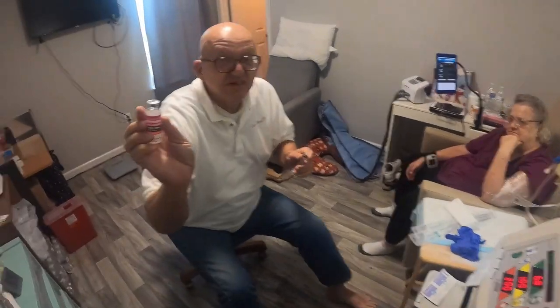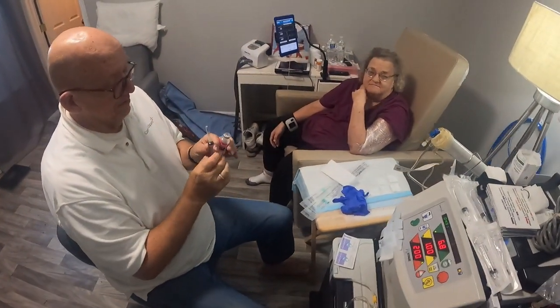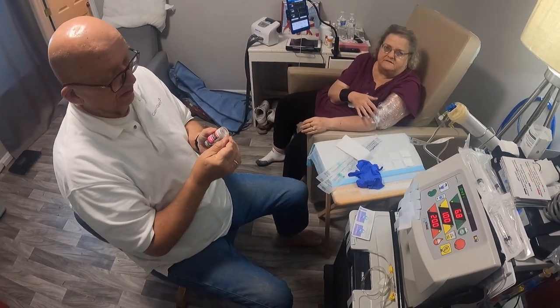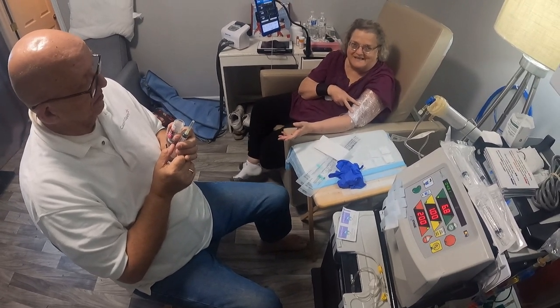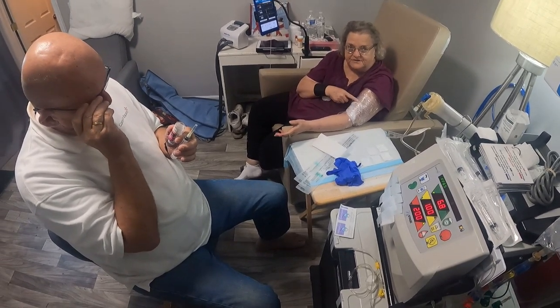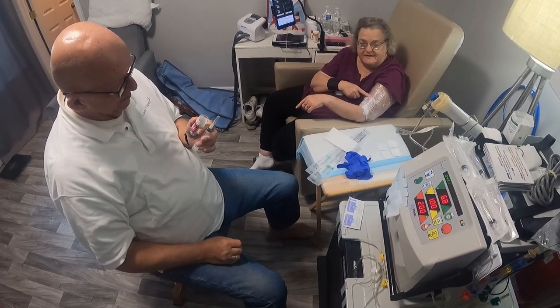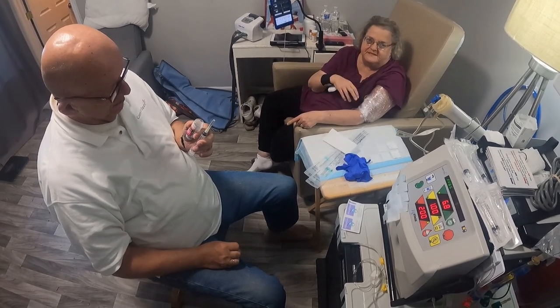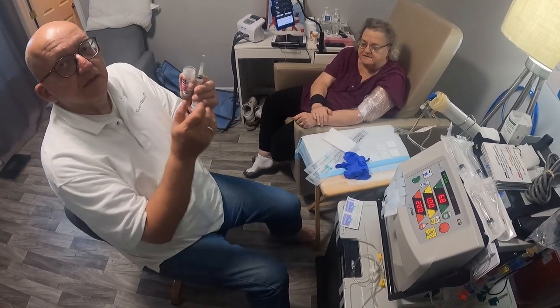This is heparin. Trisha can tell you what that does. It's a blood thinner, so it keeps the lines from clotting. We have two access points here. Well, they're not ports, they're actually in my skin, part of the fistula. We have the arterial access and the venous access. We put the heparin in the venous access at the beginning of treatment, and it goes through the whole system, so it stays in there and keeps the lines from clotting or causing any issues with blood clots.